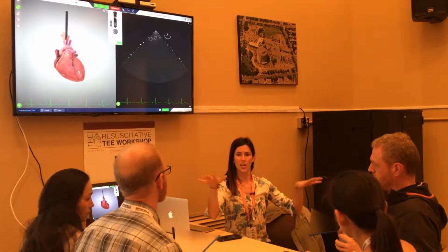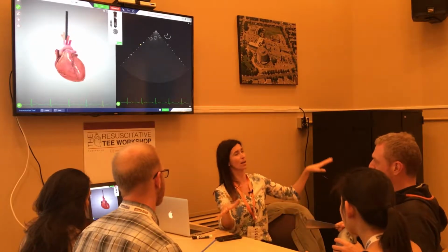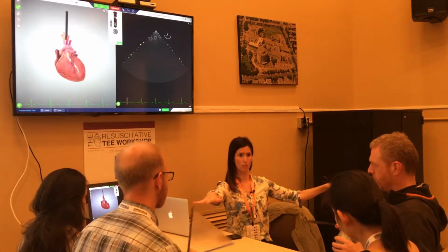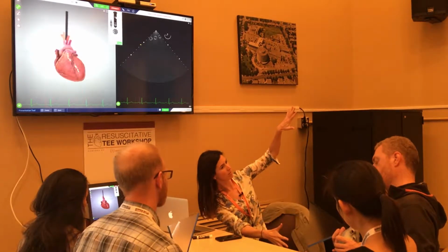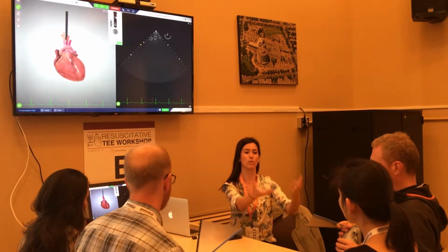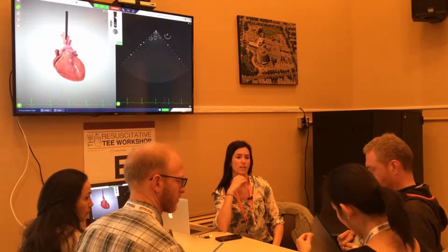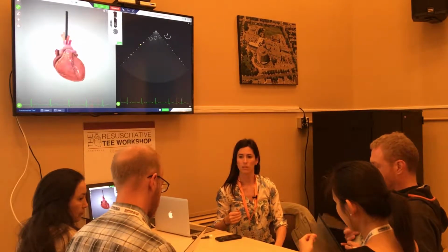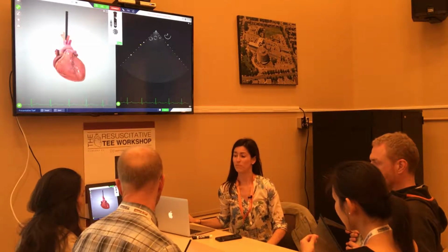They talk about changing your omniplane in a clockwise direction. That can be confusing, right? Because when I'm thinking about my clockwise direction, it's like this, but I'm looking at you, and that looks counterclockwise. So if you think about yourself as the probe, moving in a clockwise direction, I also think about my right side going down, which helps you when you start to get those upside down views beyond 90 degrees, okay? So can you show me 90 degrees on your omniplane? Yep. So starting at 0, can you show me 120? Exactly. And 145s. Yep.